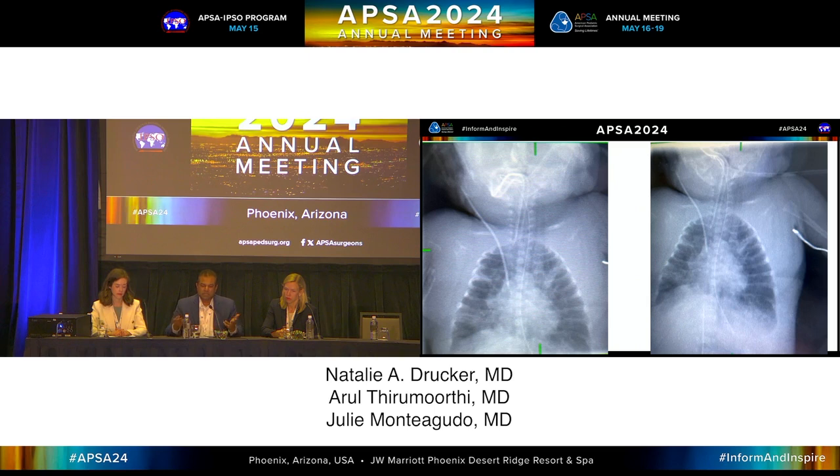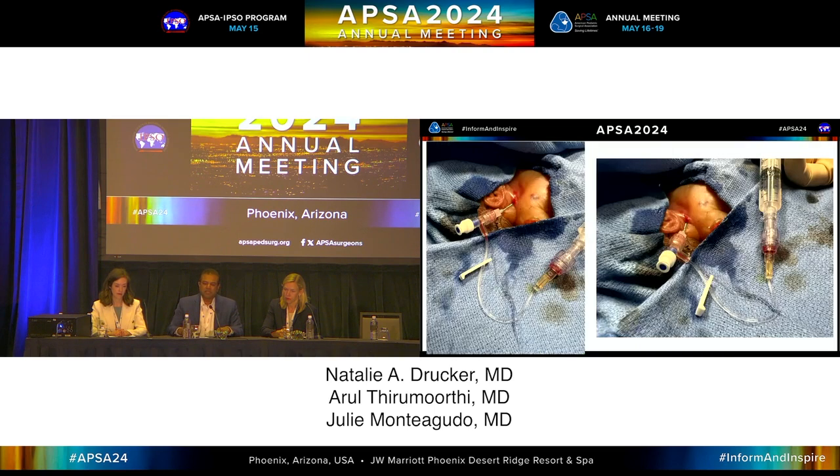And that's the completed line. And there we have it. This was actually the single lumen 3 French, because it's such a small child. But this line worked great for an extended period, and got what we needed. Well, I say extended period, through the treatment course.